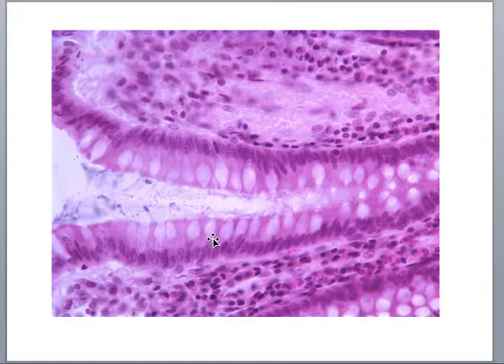So these are mucus-producing cells called goblet cells, smushed in between the simple columnar epithelium. Okay. So again, if I have the pointer here, you would tell me simple columnar for specific, epithelium for general. And these all are goblet cells. Now, remember I said goblet cells because they are shaped like a goblet, that you can see them as clear or pink. You never want to learn slides by color because there are hundreds of histological stains. So you never ever want to learn by color. You will always want to learn by structure.